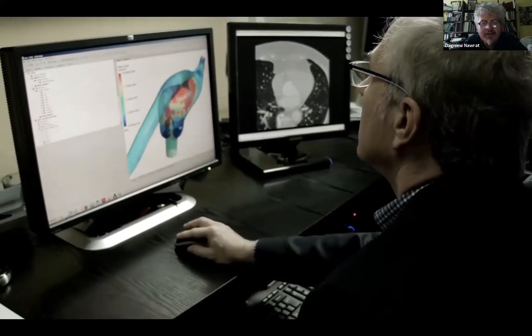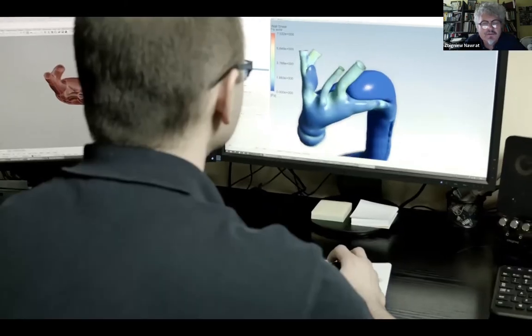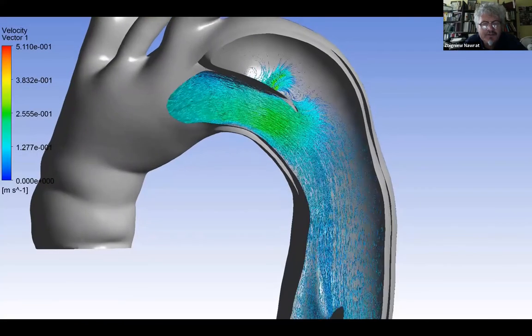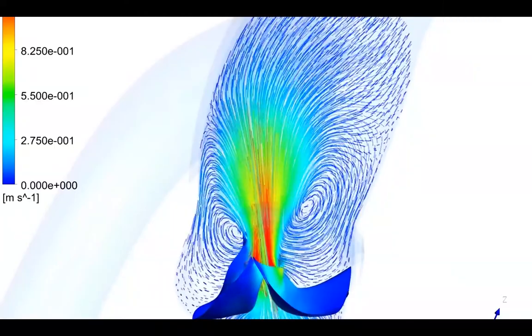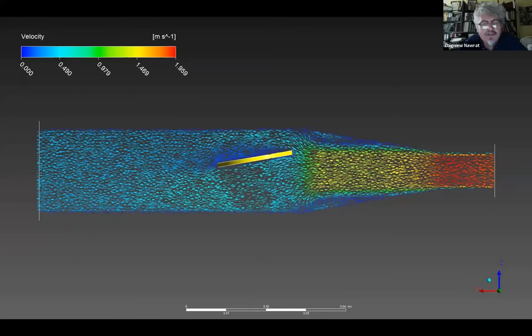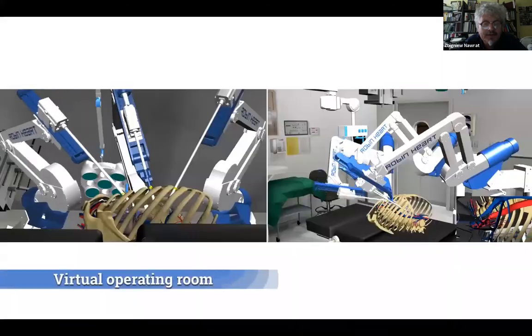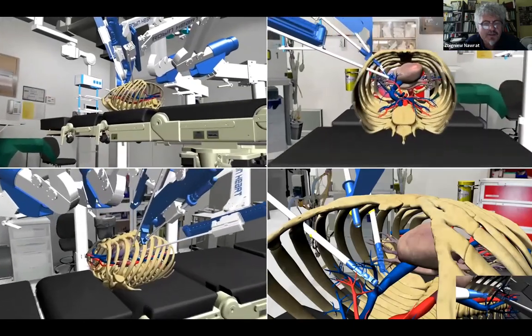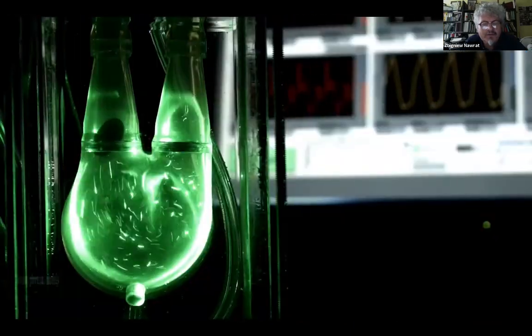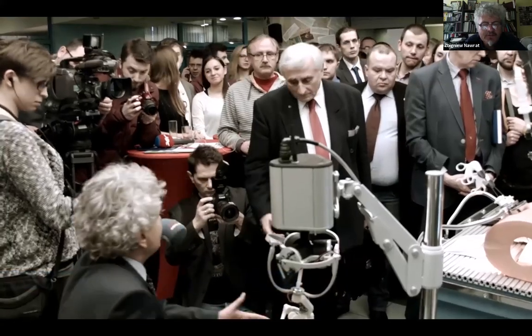For preparing the artificial heart and robots, we need simulation modeling, but we also prepare this simulation modeling for an advisory system for the surgeon, especially in cardiac surgery, of course. You can see the valve inside the body, and the valve inside a testing system to test the flow condition. For the planning system, we prepared a virtual operating room. Next, you can see laser flow visualization to test the ventricles.